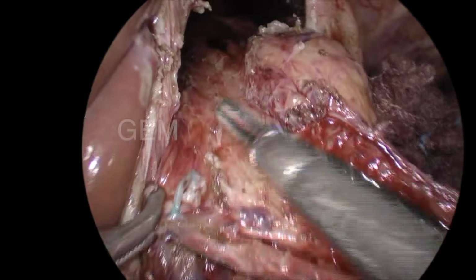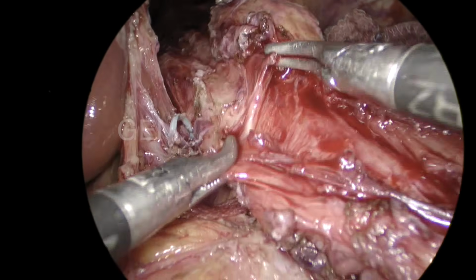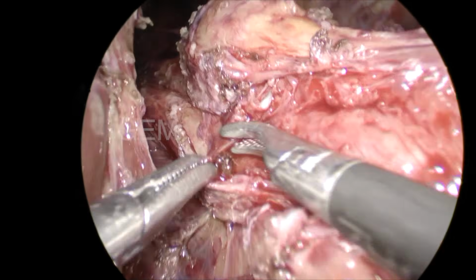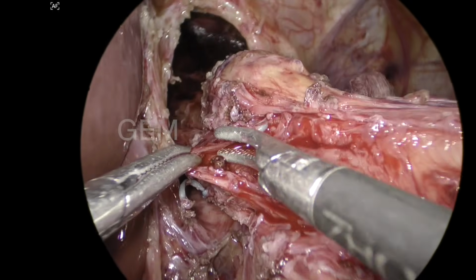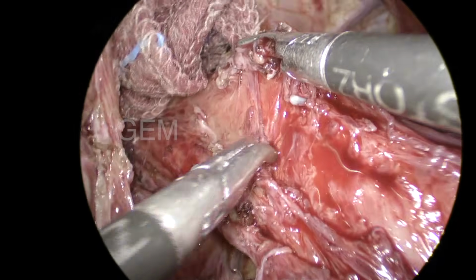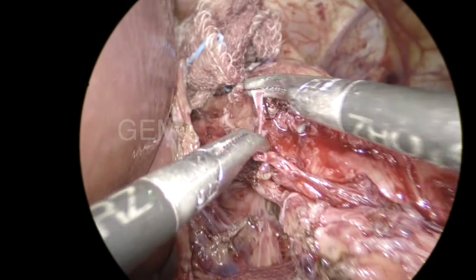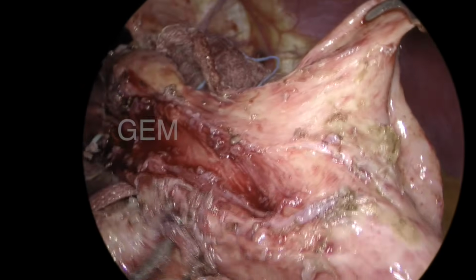So that is the esophageal wall. That is the mucosa of the esophagus. You can see some band-like muscle near the OG junction. That is the lower circular muscle of the lower esophagus. The previously operated surgeon started the myotomy about a centimeter above the OG junction, and he did the myotomy on the esophagus only, not on the OG junction.